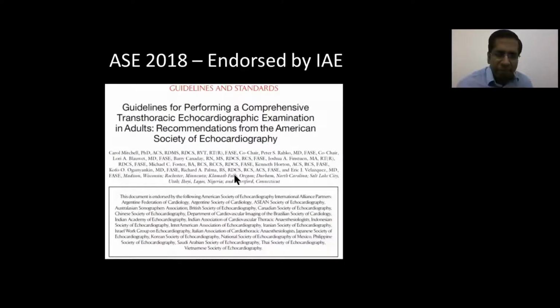This is the 2018 American Society of Echo guidelines that I will be basing my talk on. Almost all the images that I've taken are from this particular document.